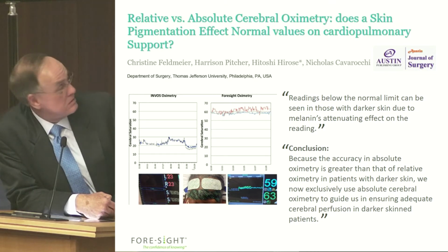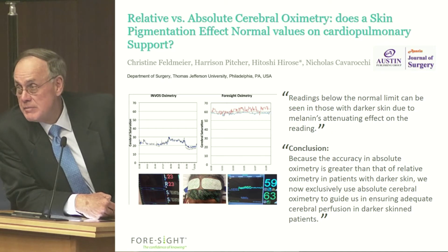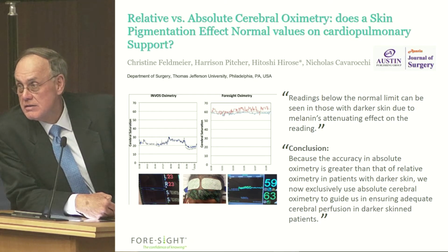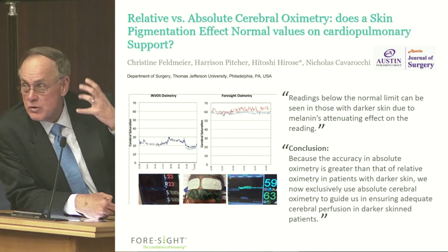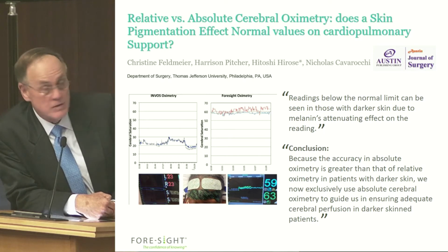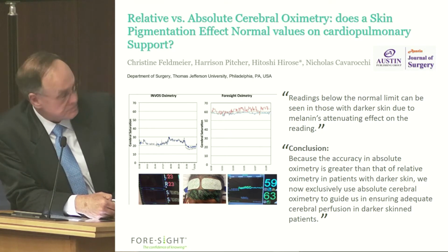And the answer is it's just that INVOS is limited by mathematics and physics. It cannot make enough calculations to compensate for the patient's dark skin color. The light is absorbed by the skin, not by the hemoglobin. And INVOS doesn't correct for that.